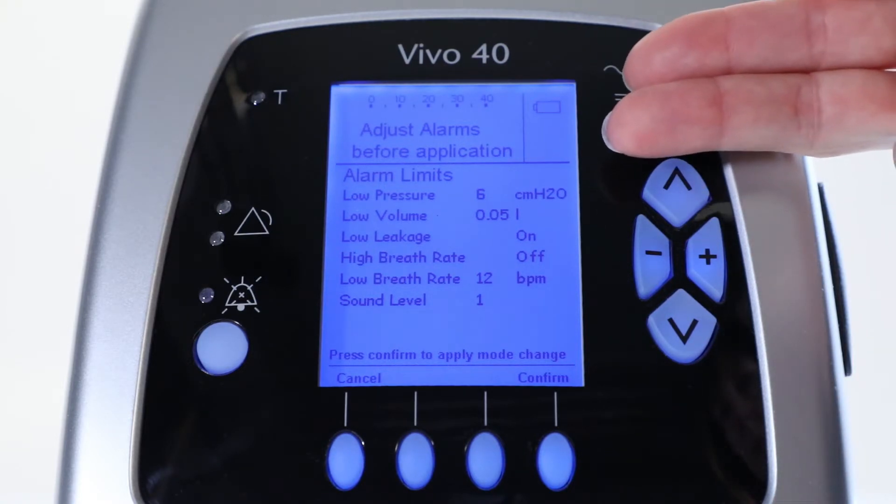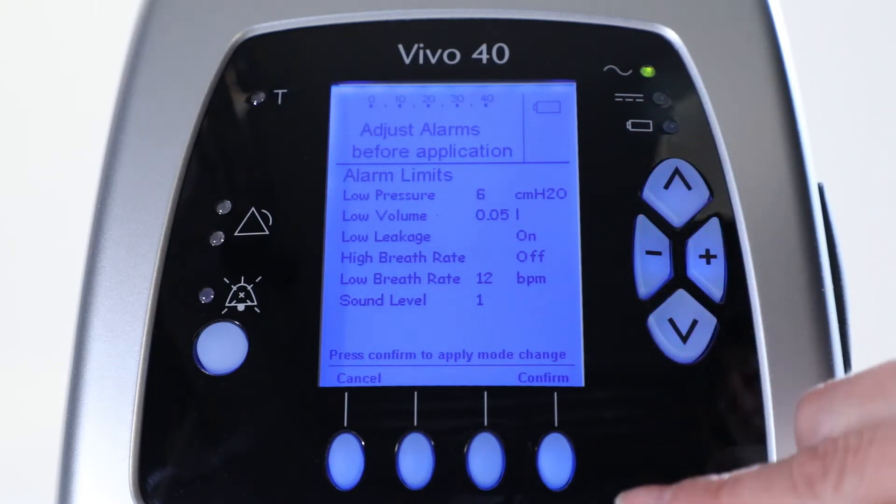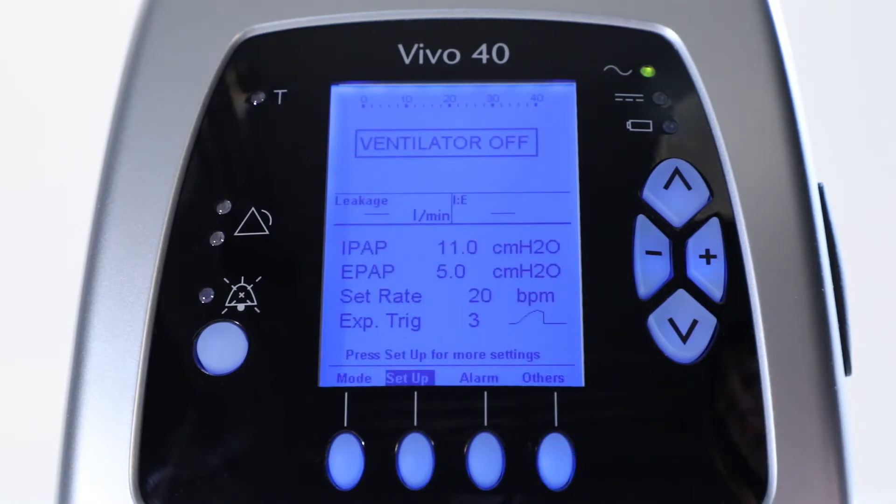You are automatically guided to the alarm menu where you can select which alarms you want to use to make sure your patient is treated in a safe way. Now, you have to press Confirm to apply the mode change.